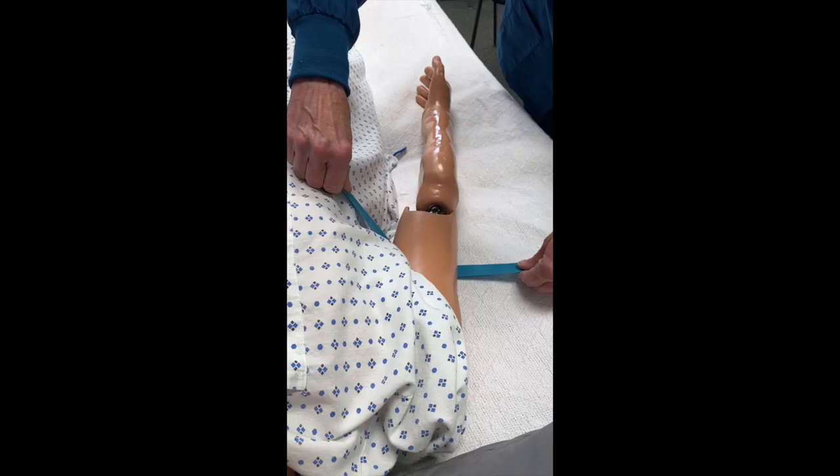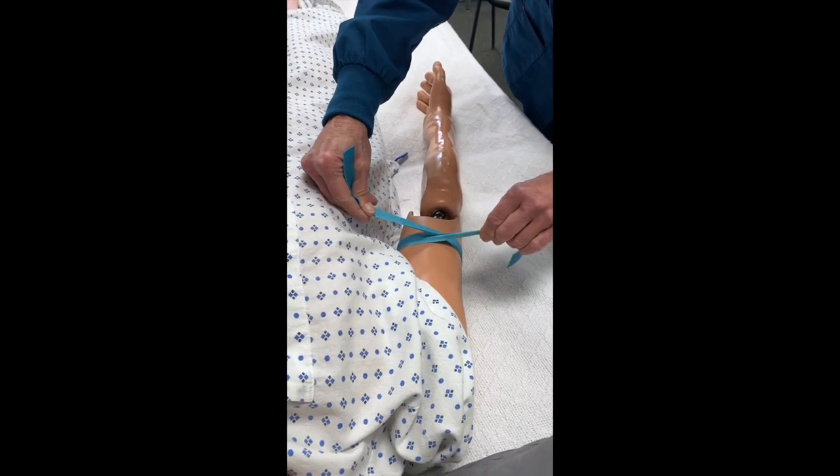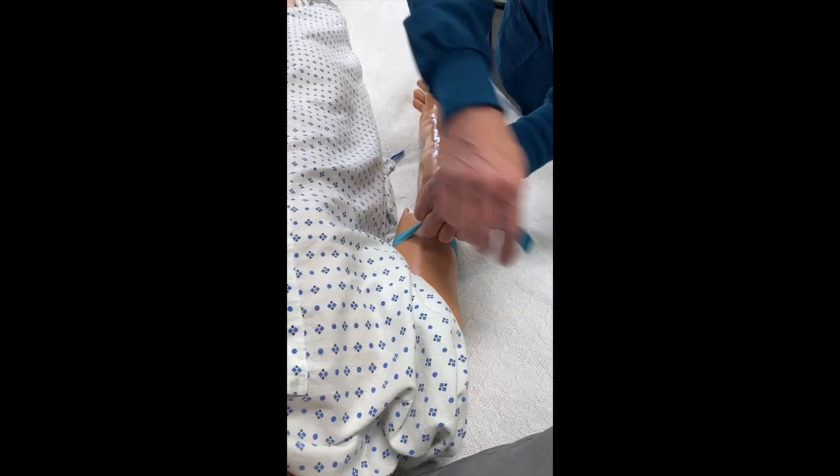Step two: cross your dominant hand over your other hand to make an X, then switch your hands.